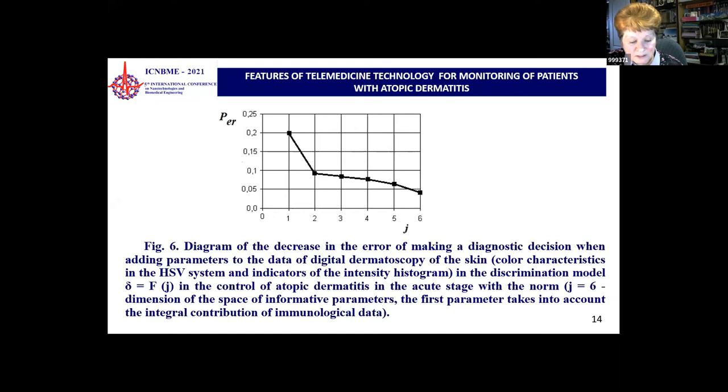Despite the fact that the relative histogram characteristic, contrast, and the presence of extrema are quite invariant to lighting conditions, they are significantly affected by the choice of the area of the analyzed skin area, especially the presence and magnitude of local maxima of the histogram.